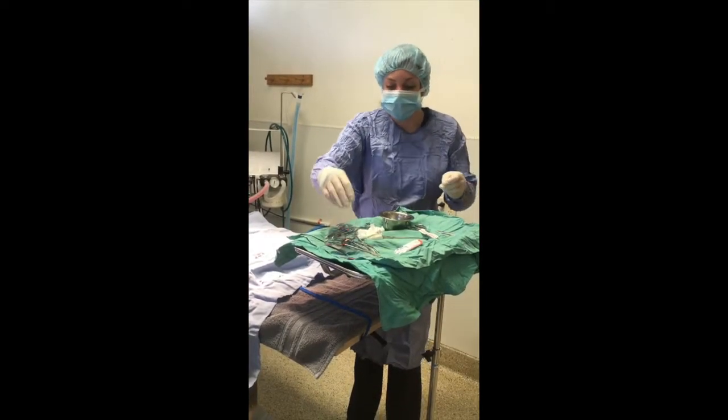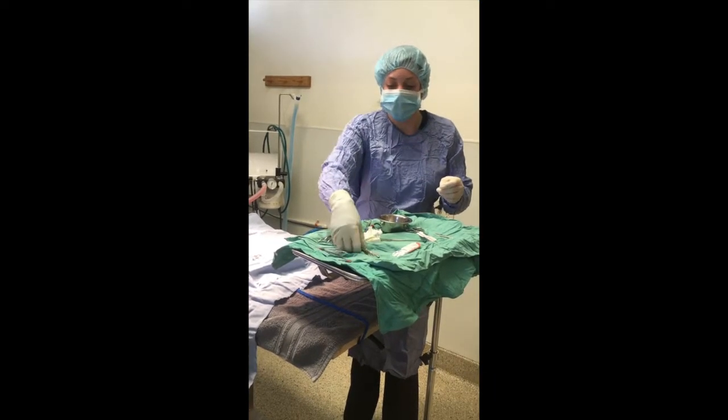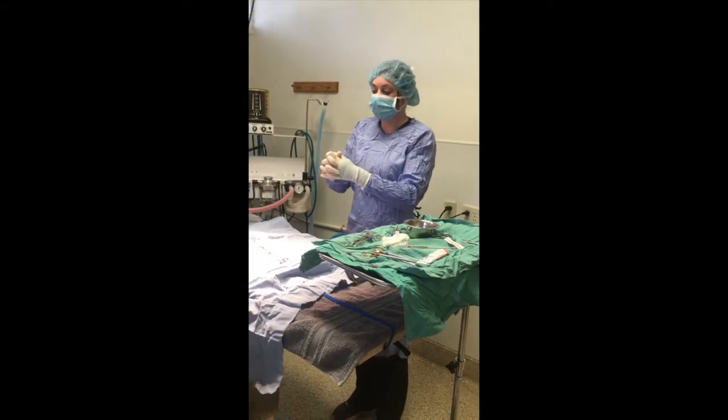So I have organized the instruments on the tray. I have all my instruments organized the way the doctor is going to ask for them. We're ready to start our study.